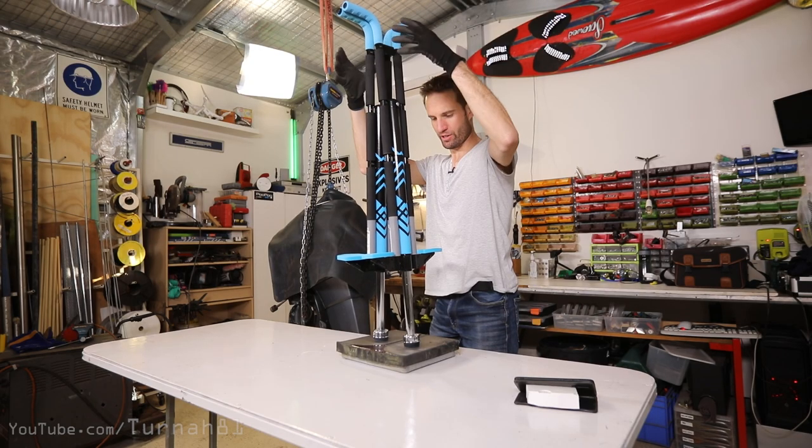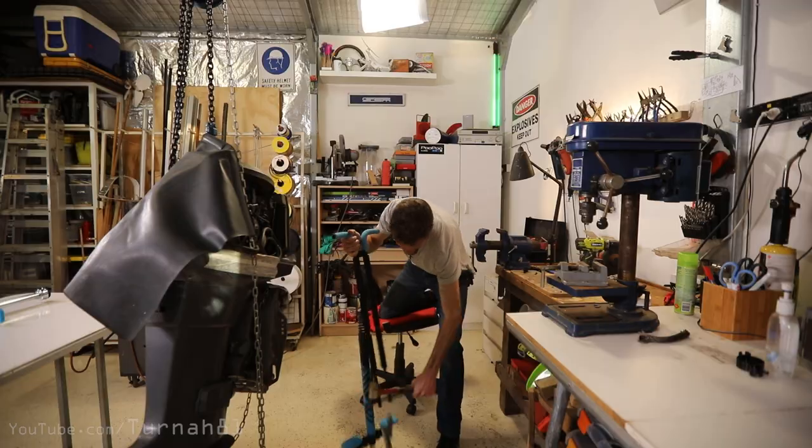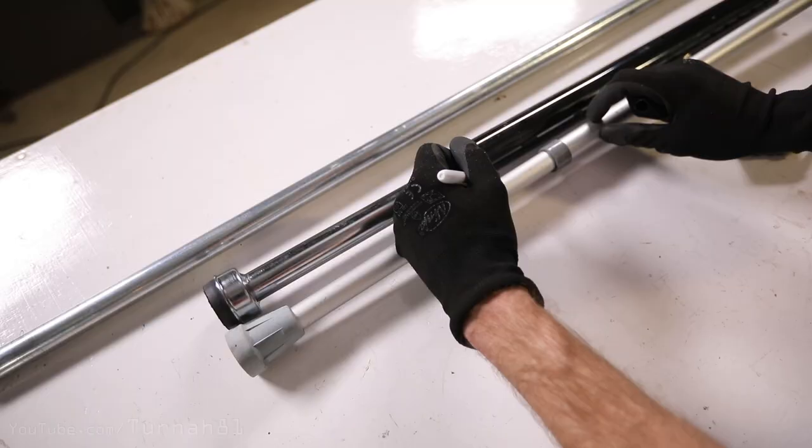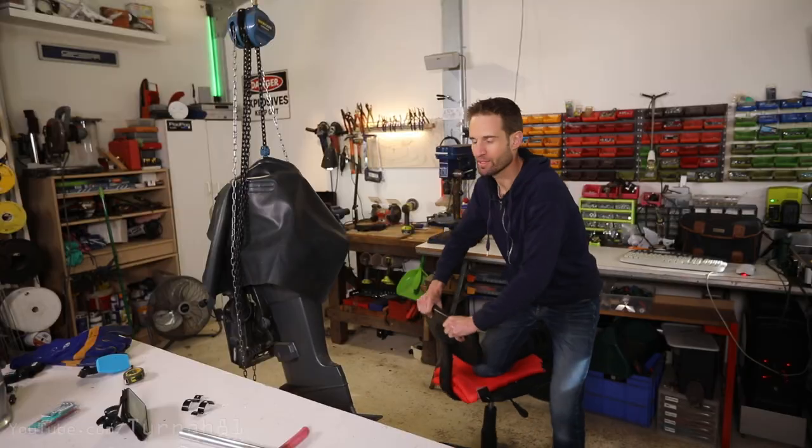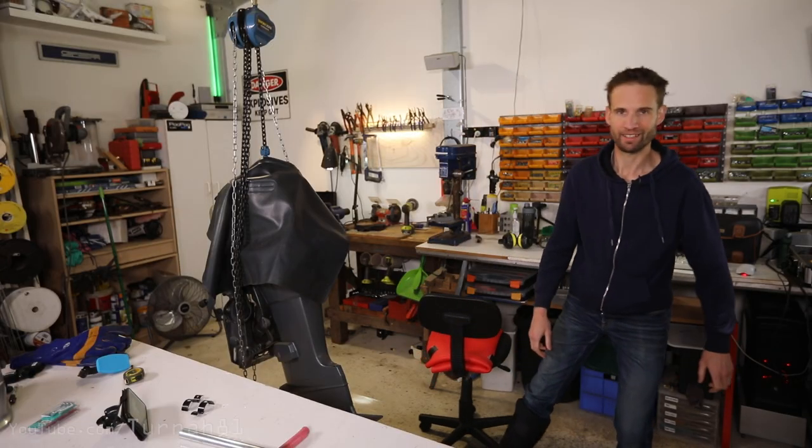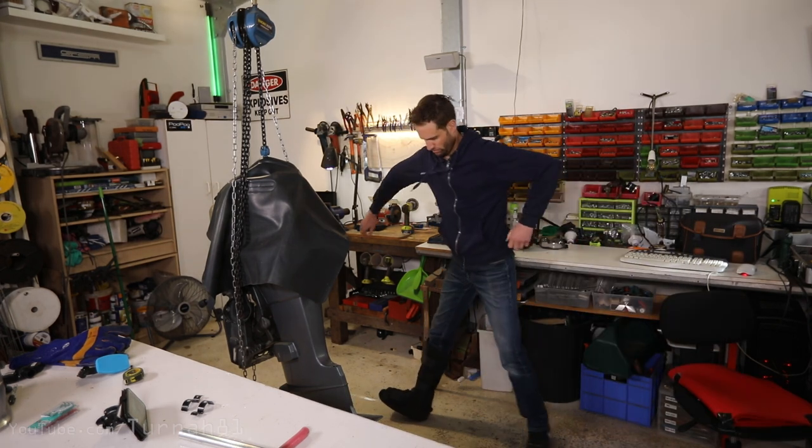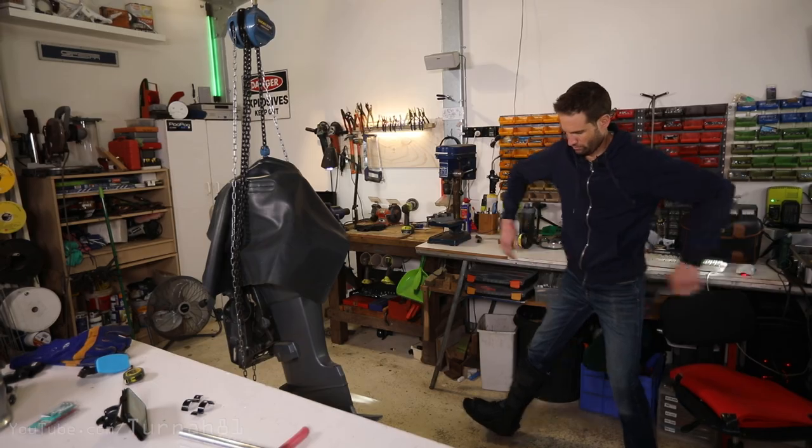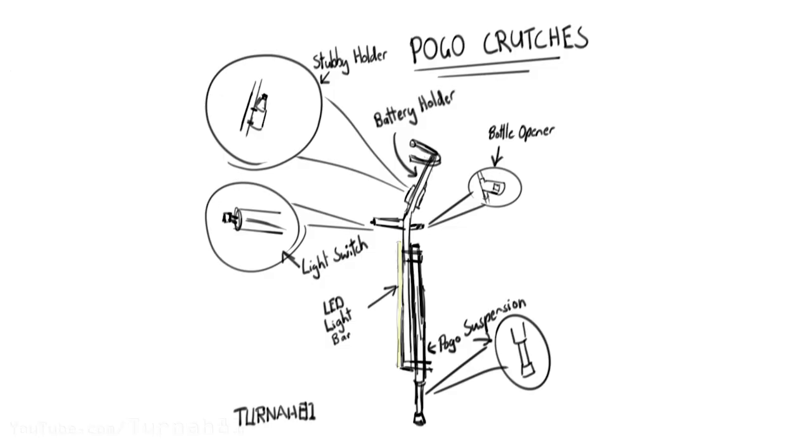So in my last video we got a bit of a plan together, broke some stuff and started welding things. Since starting this project though I found that my foot is well on its way to recovery allowing me to start load bearing with it. But what better way to undo that progress than to finish building the world's first pogo crutches?